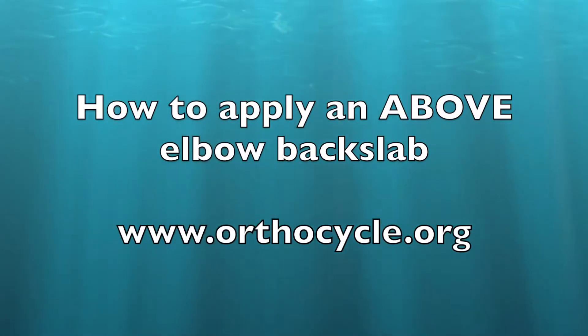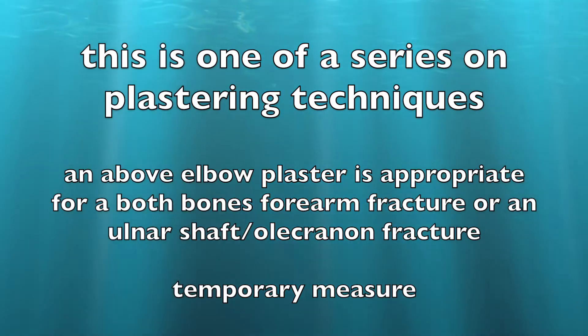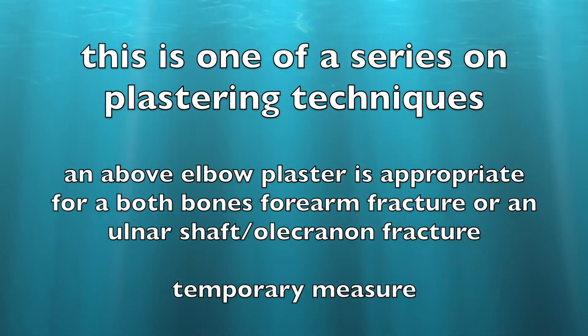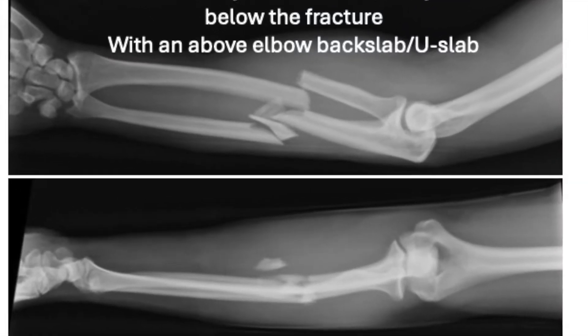In this video we're going to learn how to apply an above elbow back slab. This is the type of back slab that you might apply to a forearm fracture so that you can control the joint above and the joint below. This would be a temporising measure before surgery to apply plates to both bones.